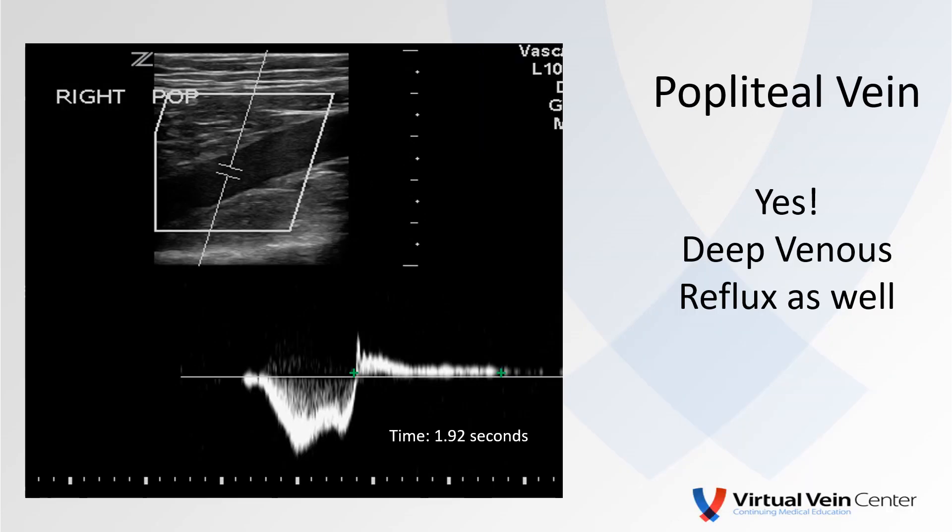I would note, however, that the larger the vein, the valve cusps are probably pulled further apart and more likely to exhibit reflux within that vein segment — which, in fact, this patient certainly did. You can see the distal compression and almost two seconds of retrograde flow following release.